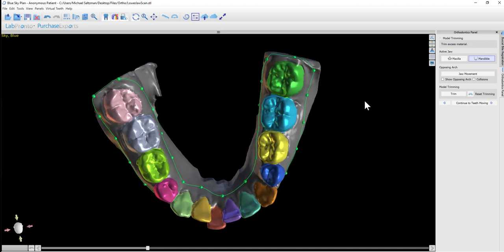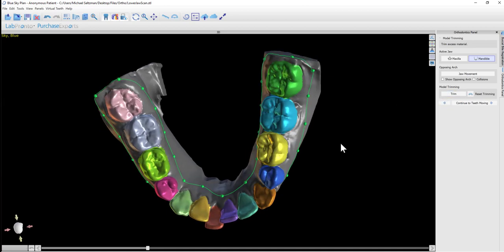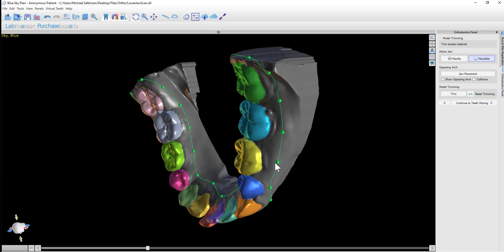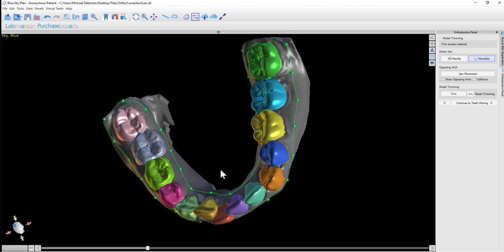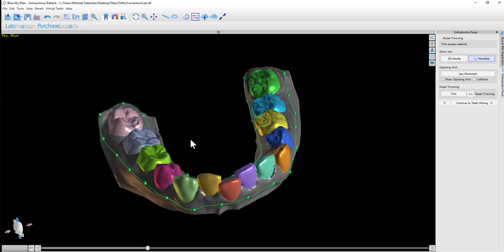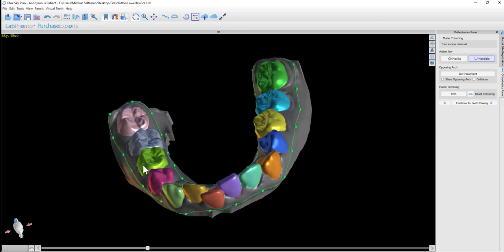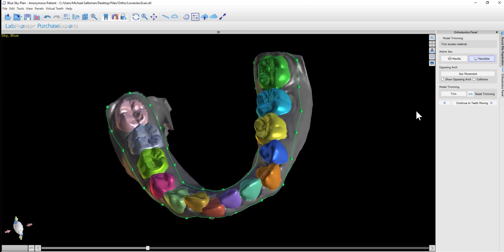Before we click Trim, if we make any modifications to the curve and want to undo them and go back to the software's suggestion, we just click the Reset Trimming button. Once we have the curve the way we like it, we click Trim.